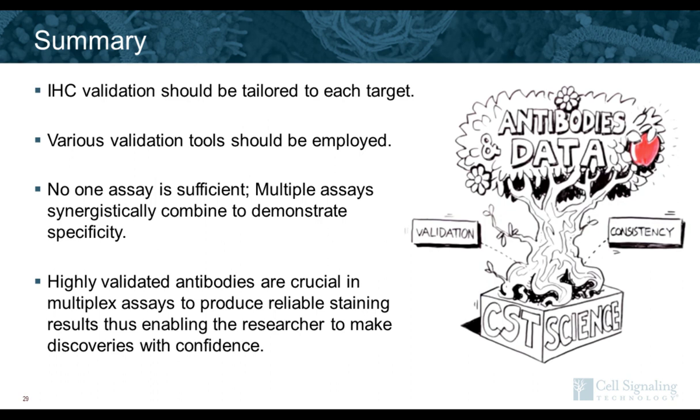Thank you. Now, what was used on the cytokeratin C11 clone as far as blocking? As Bill mentioned, that clone is biotinylated, so we didn't have to detect it with anti-mouse HRP, so that's how we avoided any mouse-on-mouse cross-reactivity in that setting.